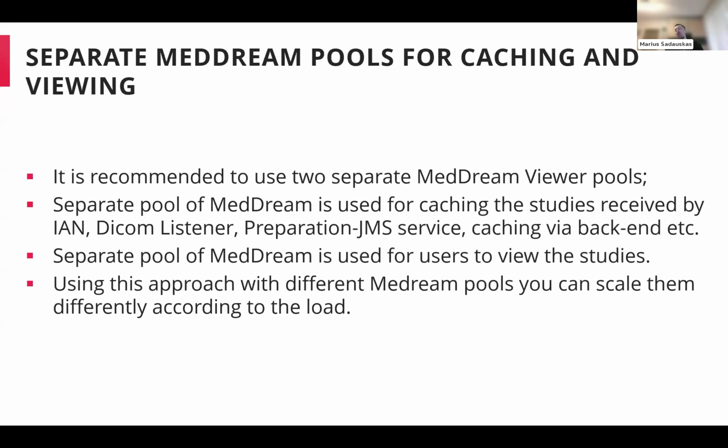And if we talk about, let's say, higher load, bigger installations for high availability, and not only for high availability, but in general, even if you use one MedDream instance, it would be good to think about it, and we would recommend using two separate MedDream Viewer pools, if we could say that.